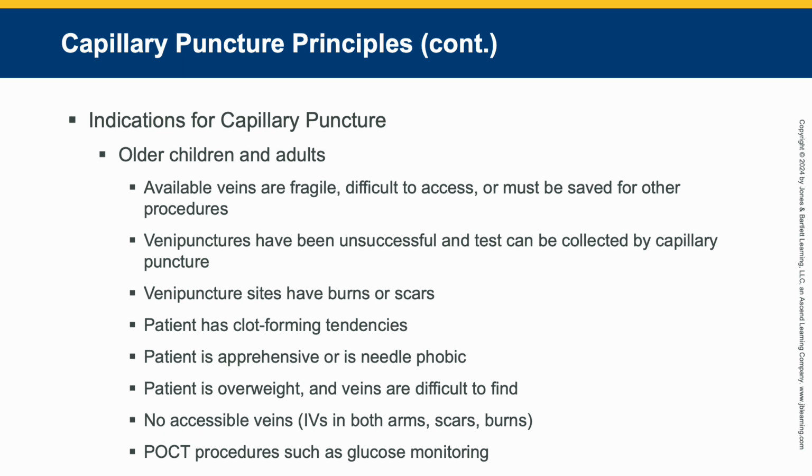If they are extremely apprehensive or needle phobic, they may be more comfortable with you doing a capillary stick. And if you can get the amount of blood that they need with the capillary stick, if they are just terrified, then you can do it if that's the case.